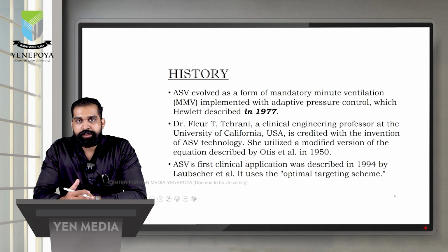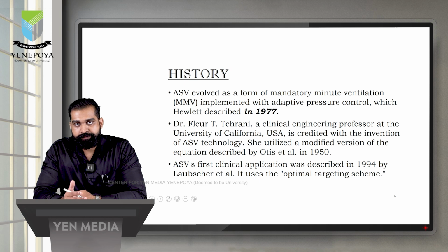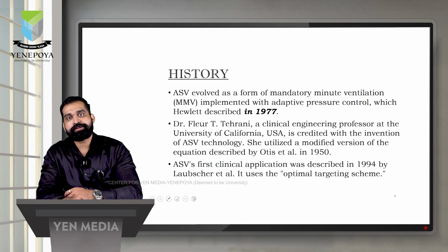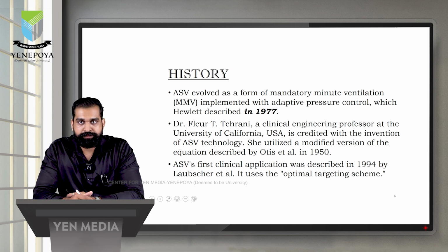Now, unlike any other mode which is designed for a specific phase of respiration, this mode can be used in all kinds of patients, adult and pediatric, from the initial point of mechanical ventilation through the monitoring phase until weaning, as it is not designed for a specific phase of mechanical ventilation. This can be used in patients who are passive and can be used in patients who are active.